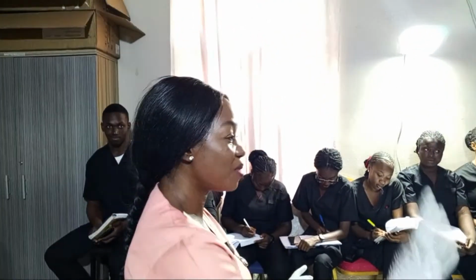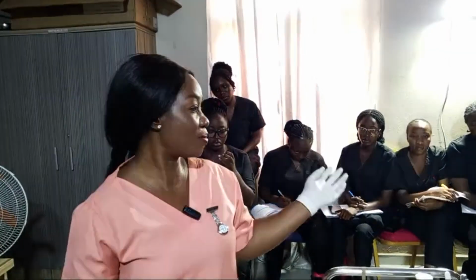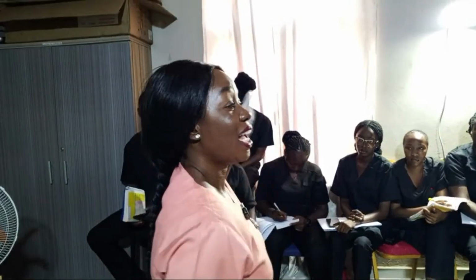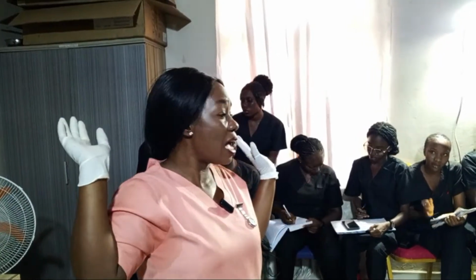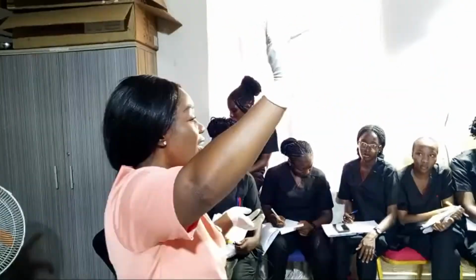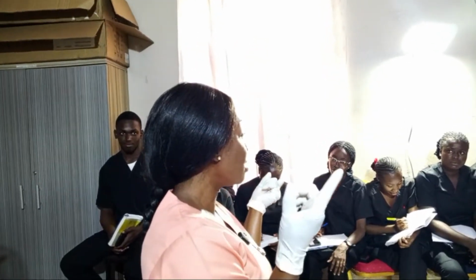Please do not forget to start with physical examination. Do you know that during exams, physical examination carries almost all the marks? So if you skip physical examination, you have skipped almost all the marks, and you say I will just do the chemical exam like glucose, ketones, proteins. That one is just like 1 mark. Please do it step by step.